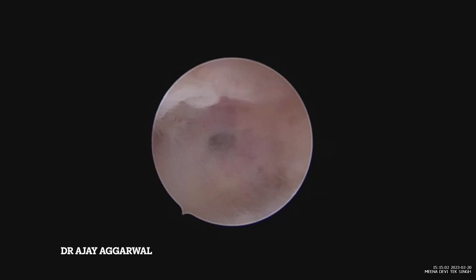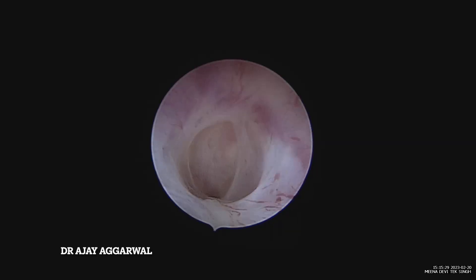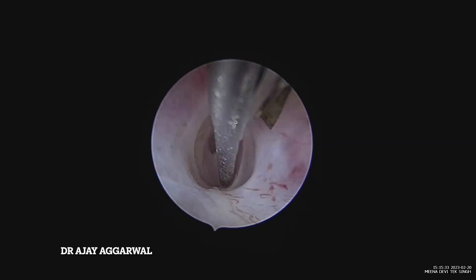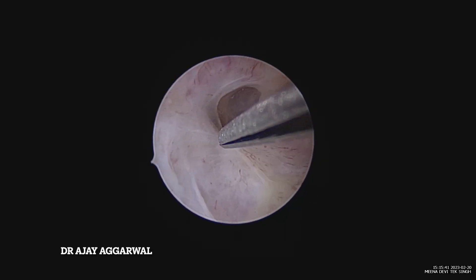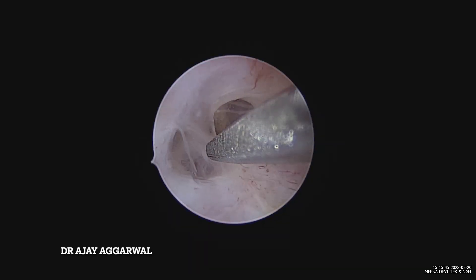Good morning everyone. Today I am going to present a case of hysteroscopic adhesiolysis in a case of secondary amenorrhea with primary infertility, who was diagnosed to have some calcific foci in the endometrium. There was a suspicion of genital tuberculosis.